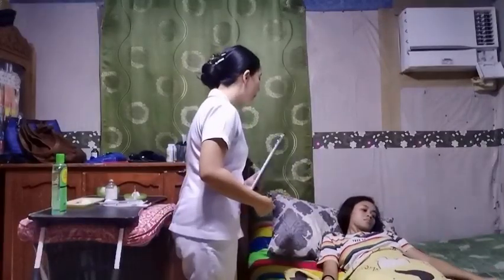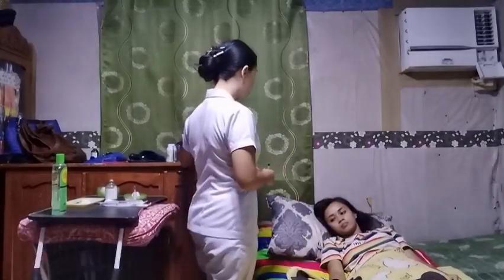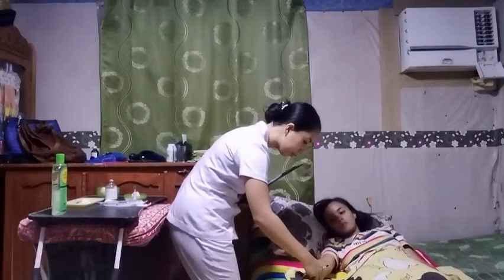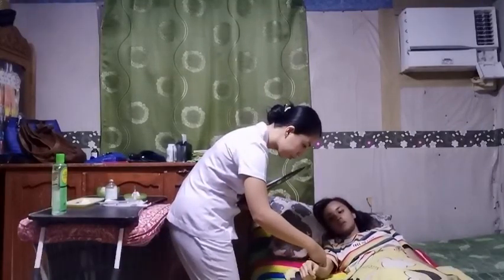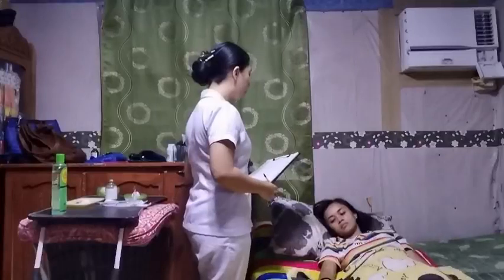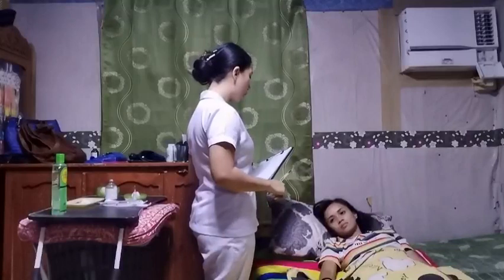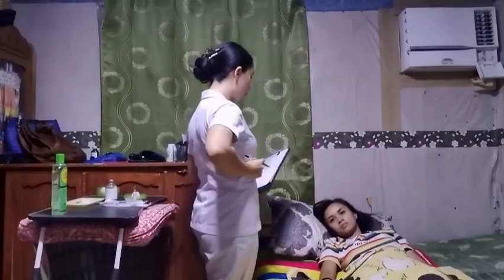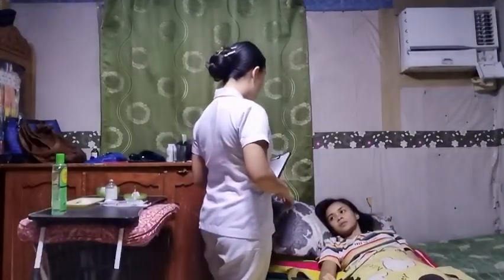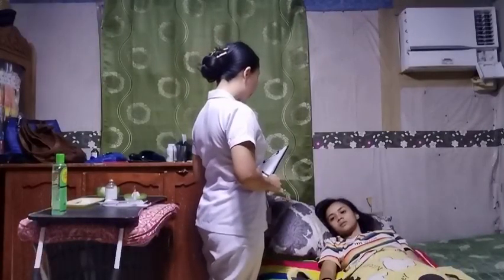So good morning, ma'am. I am Ana Maris Briones, a student nurse for today. So may I see your wristband, please? Can you state your name, please? I'm Ali Briones, my age is 19 years, my birth date, April. Okay, ma'am. Today I will be doing the subcutaneous insulin, and I will inject you insulin in this part of your abdomen. Insulin is to control your blood sugar since you have type 1 diabetes. Will that be alright, ma'am?